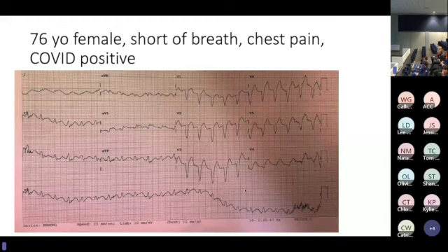But that's an interesting one where it really looks like it meets cath lab activation. It is tachycardic, but still with the elevation and the reciprocal changes, and the decision not to go to cath lab because there's probably another diagnosis. I think she did have elevated troponins, but probably nothing too impressive on the first one. Any comments about that case, or what other people would think in that scenario? Chloe's giving me a thumbs up. Okay.